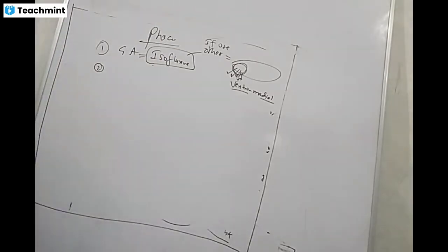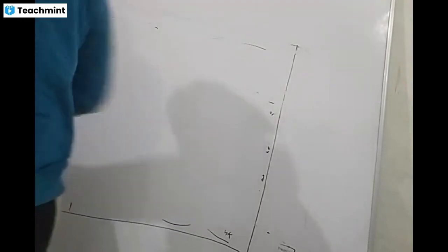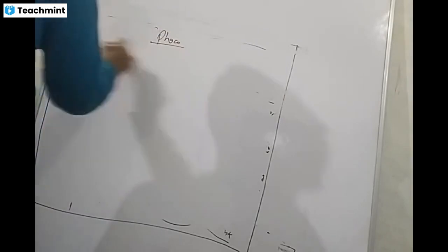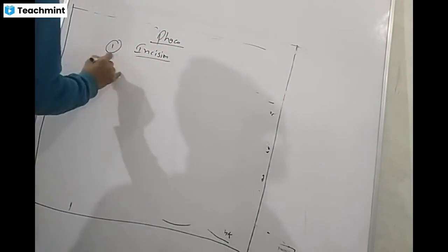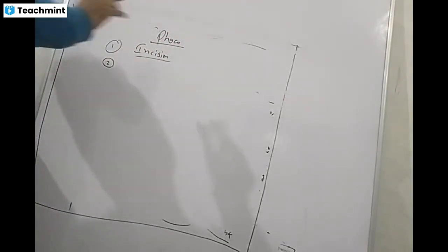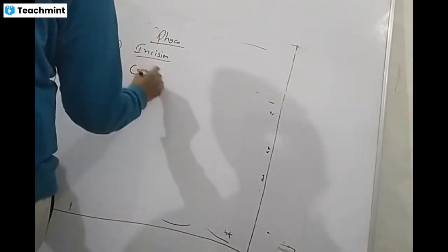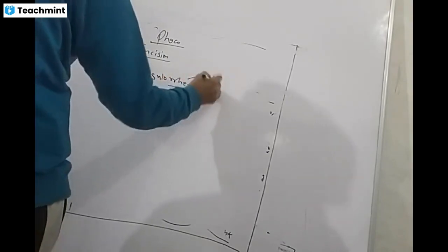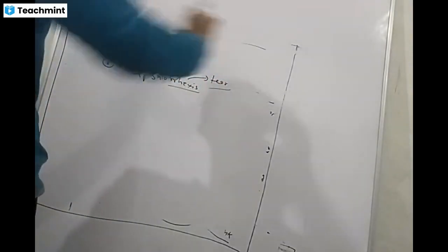After anesthesia, the main steps of this technique, phacoemulsification: First is incision, how to enter the eyeball. Second, capsulorhexis. Rhexis means tear. If you enter the anterior chamber, the capsule is there, and inside the capsule, the lens is there.